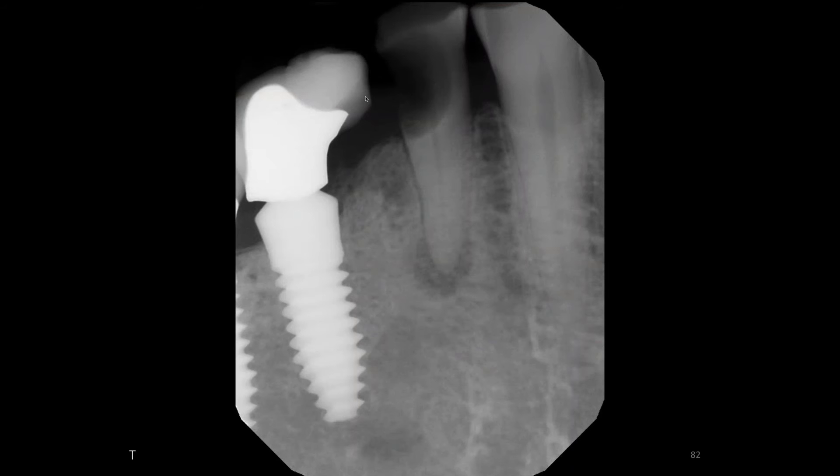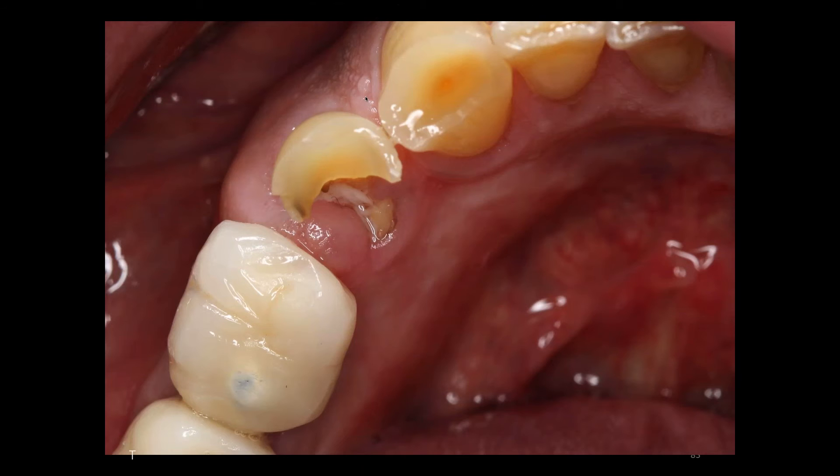I'm going to use the technique that I demonstrated earlier. We're going to make a purchase point, place our beak onto the lingual aspect, put the bumper as far down the vestibule as possible. You can see in this situation they have a very shallow vestibule. Rotate my wrist towards the shoulder, and in a manner of a minute or so this tooth will pop.